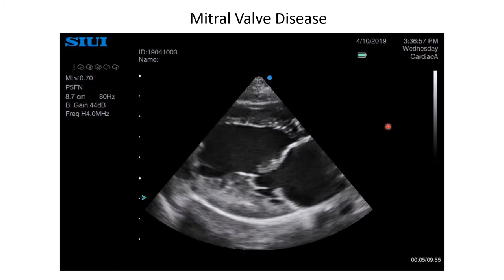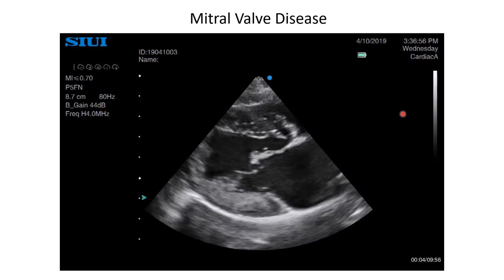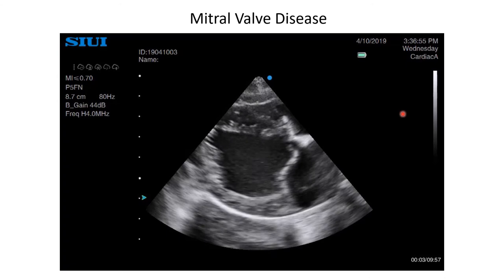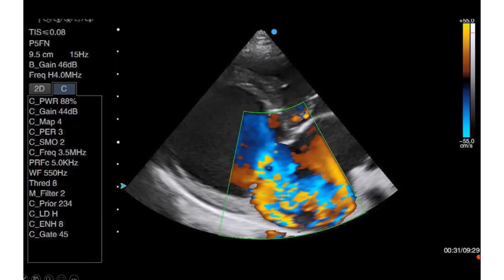In this example, the anterior leaflet is thickened, and as it closes, part of the leaflet body prolapses back into the left atrium. This will result in regurgitation — blood going back into the left atrium through a leaky mitral valve during systole, instead of all going out the aortic valve as it should. You have other associated signs even before you turn on your colour Doppler, and most obviously, this is a dilated left atrium. In this case, the dilatation is due to the volume of blood that is being forced back into the atrium.